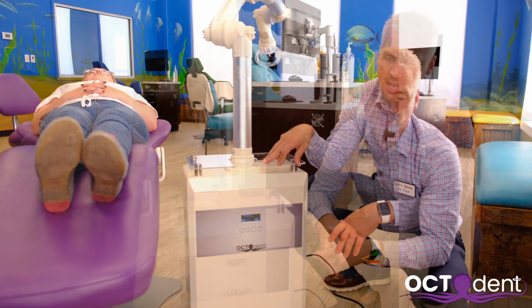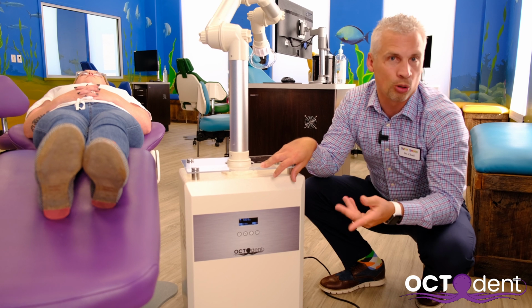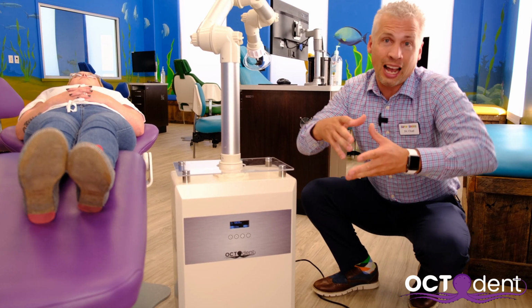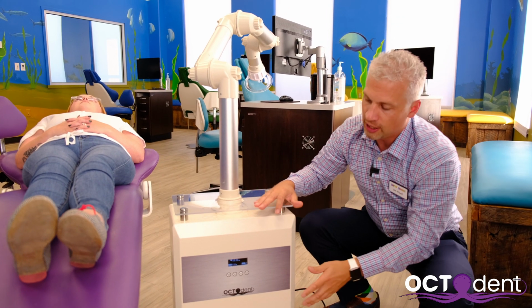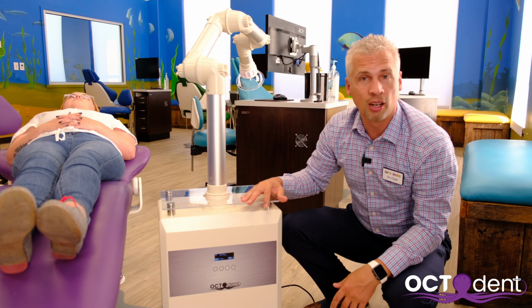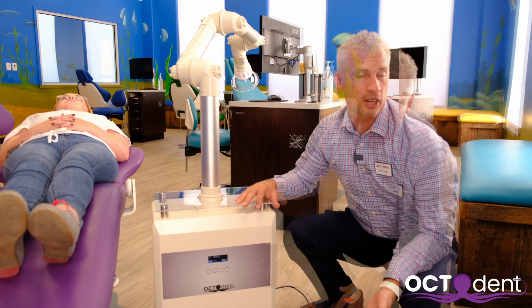If I have a situation where I have a patient who is moving a lot or gagging or sitting up, or is a large patient that I might have to move it a little bit further away, and it's just uncomfortable to get all of our hands in there, at that point I would move it all the way up to 10. And at this level it's kind of loud. I can still talk, but it's not comfortable, so I don't like to have it at this setting unless necessary.